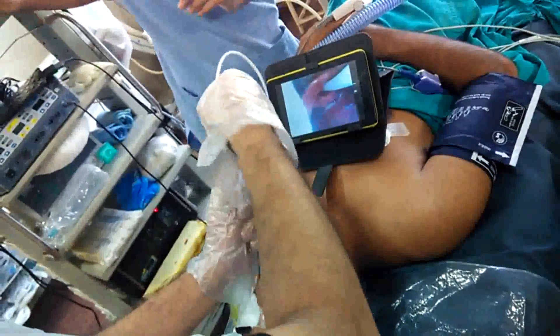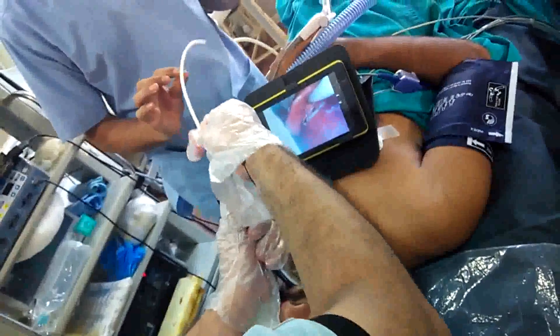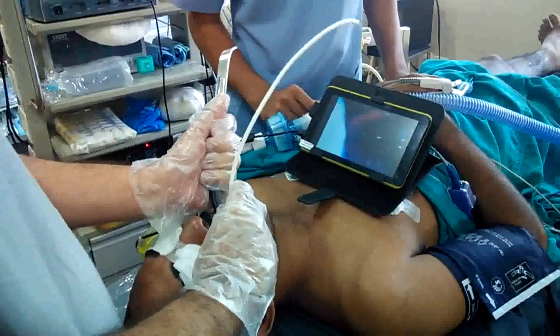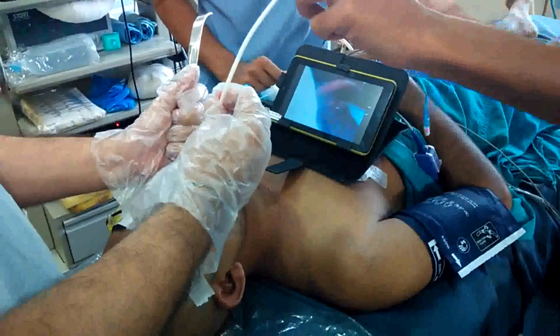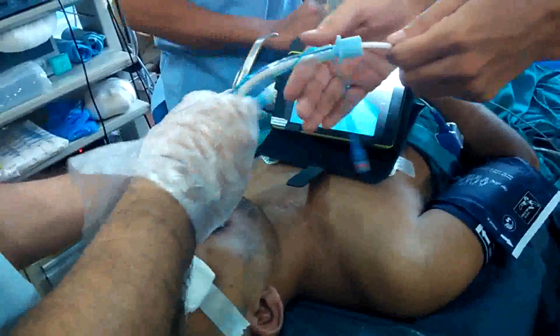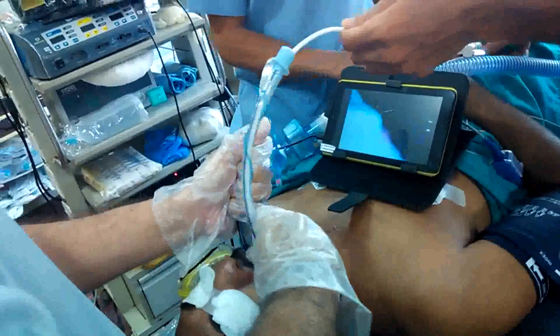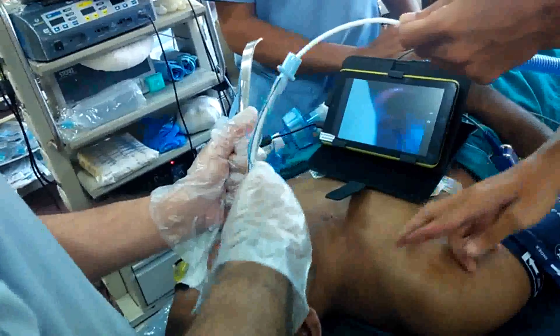The bougie has entered inside. I am reloading the tube over it. From the little space available here, to the side of the mouth, I am trying to advance it.